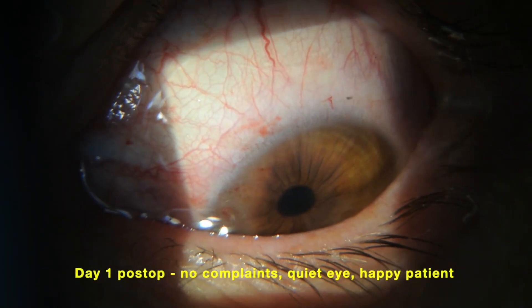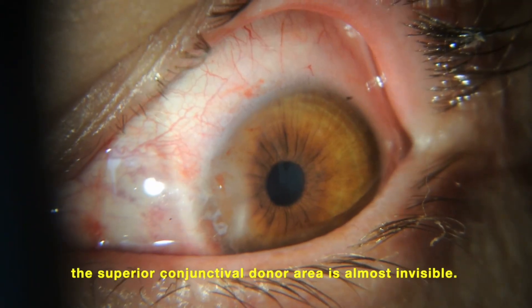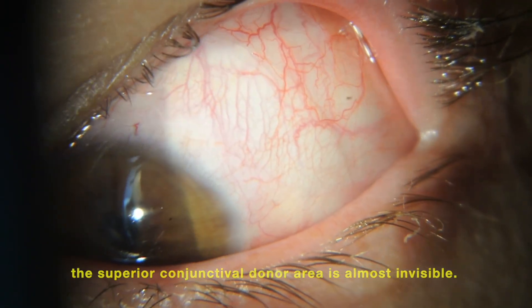Day one post-op: no complaints, quiet eye, happy patient. We can see that the superior conjunctival donor area is almost invisible.